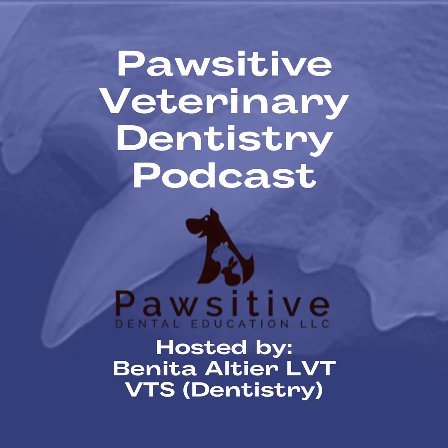And so then we get to have that discussion. How do you discern a pathology from anatomy? And what resources do you have in your clinics that you can use to discern those things? Fortunately, if the animal has the other side there and it hasn't been removed for some other disease process, the animals have their own controls. So you can look at the other side. You could look at a skull. You could look at other images of that particular region that you may have x-rays of. You look at your textbooks. You can look at a whole myriad of other things to help you decide.